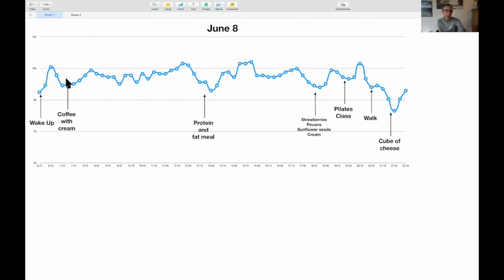And as I said to you yesterday, I'm making some assumptions about calibrating this because I'm trying to bring it in line with the blood prick tests when I do them. I've done a couple again today just to calibrate it. So the key thing is perhaps not worrying too much about the vertical position of the curves. It's all staying fairly controlled, other than a dip just before I went to bed. I stayed within 1 unit of the millimole per litre scale, between 5 and 6.